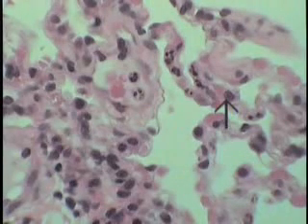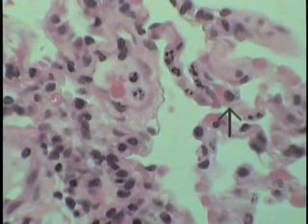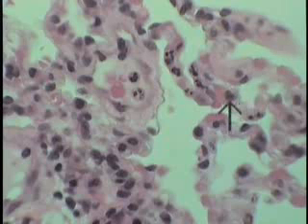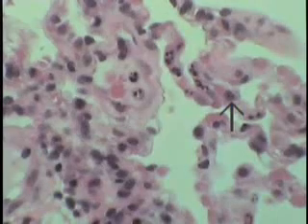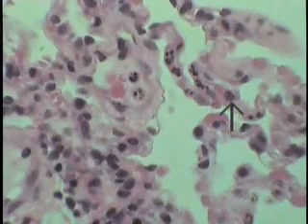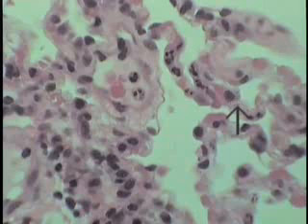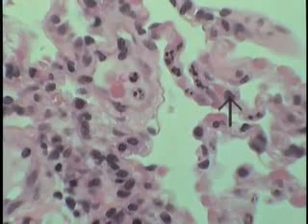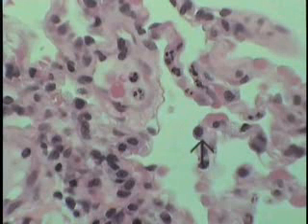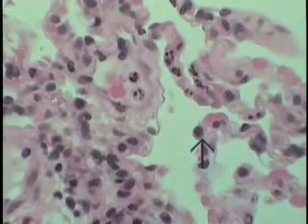The type 2 pneumocyte located here generally has a cuboidal shape. Its cytoplasm is filled and appears vacuolated with these little myelin bodies. These myelin bodies or whorls of material are thought to represent surfactant. So this is one shown here, a type 2 pneumocyte. Another one here is sticking out, actually protruding into the lumen of the alveolus.